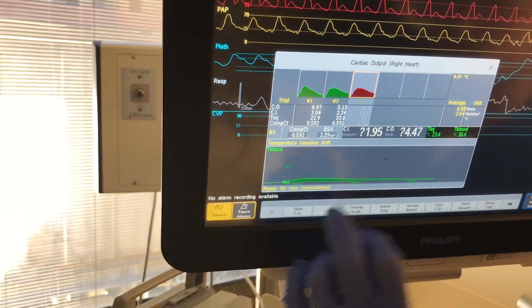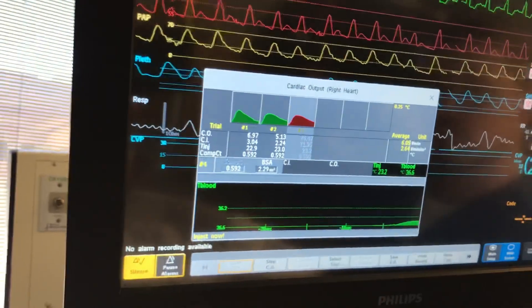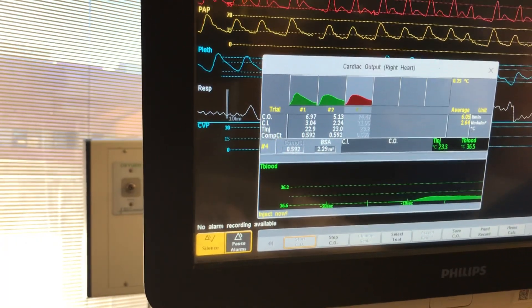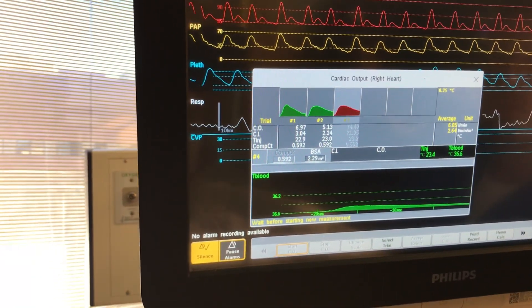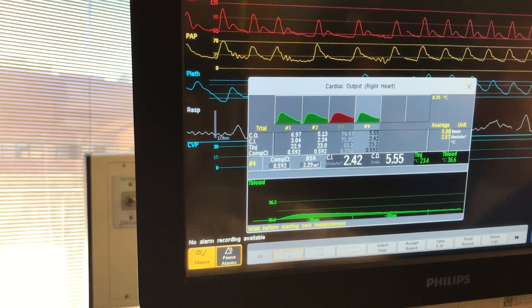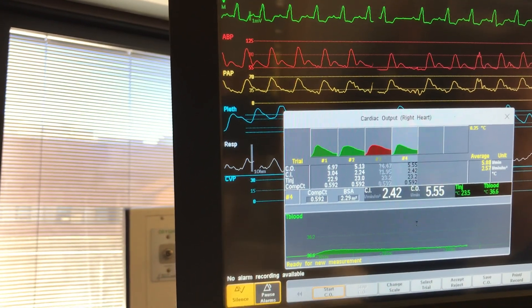You're just looking at the CO number — cardiac output. All right, start. That one looks good. Do you want to use those three or do one more? Let me do one more. I might get rid of that 6.97, so I'm going to do one more. All right, you pulled back.